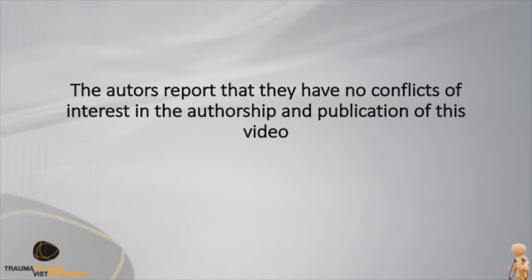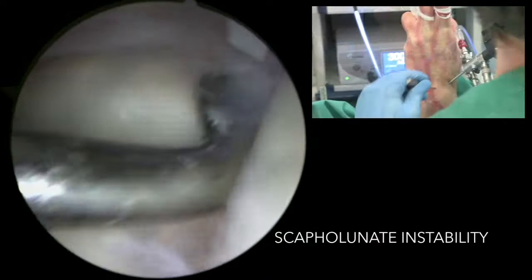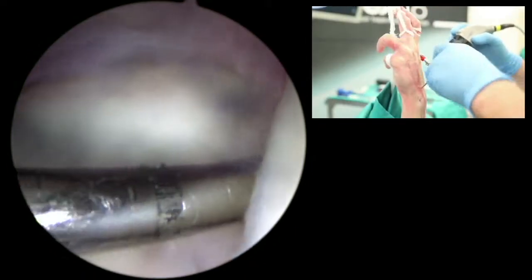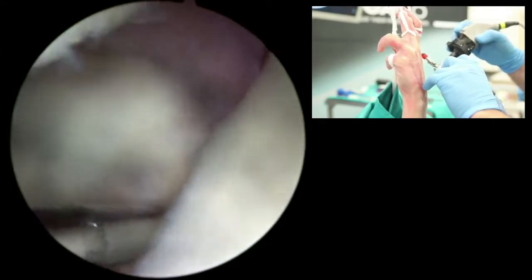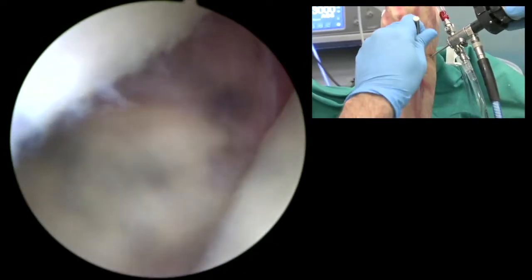Scapholunate instability is evaluated and classified from radiocarpal portals 3-4 and 4-5, and midcarpal radial and ulnar portals. The fibrous and inflammatory tissue from the dorsal portion of the scapholunate ligament is cleaned with a shaver. According to where the ligament tear has been detected, the cortex of the insertion of the scapholunate is prepared to stimulate healing.